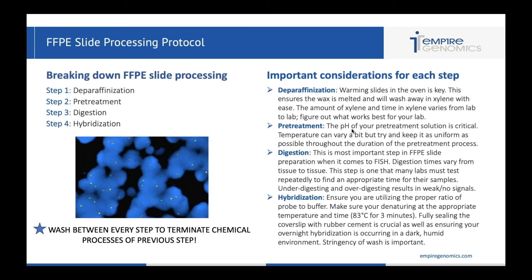You definitely want to make sure that you're denaturing at the appropriate temperature. Some labs denature at the temperature they use for blood — 72, 73, 74 degrees — but you want to up it for tissue. You want to do around 83 degrees Celsius for three minutes, and I often see lack of signal because labs are not denaturing at a high enough temperature. Finally, you want to fully seal the coverslip with rubber cement — this is crucial to make sure the probe does not dry out, keeping it moist and allowing for proper denaturation and hybridization. Be sure that it stays in a dark, humid environment during hybridization.